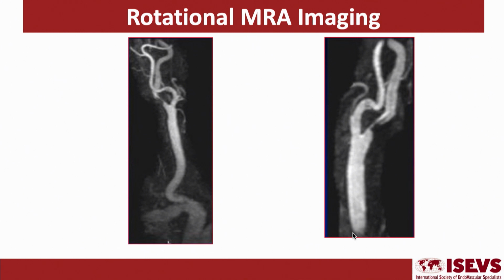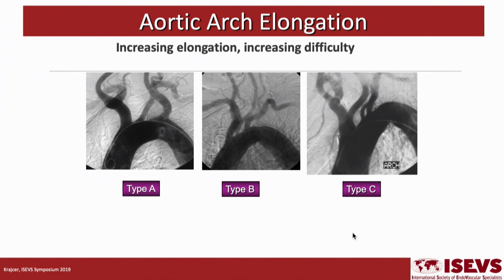Let's say we could do a carotid artery stenting, like this patient has a severe internal carotid artery stenosis via femoral approach, but if we have a very complex arch, it might be better to do a TCAR or direct access to the carotid circulation and avoid complexities and risk of embolization of the atheromatous material during the intervention using a femoral approach.